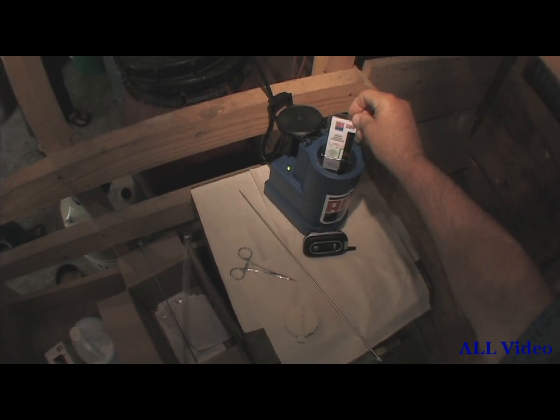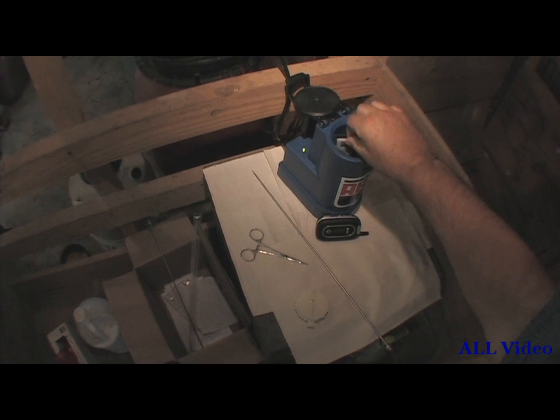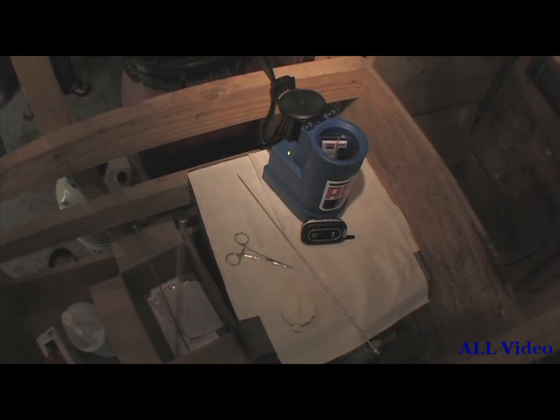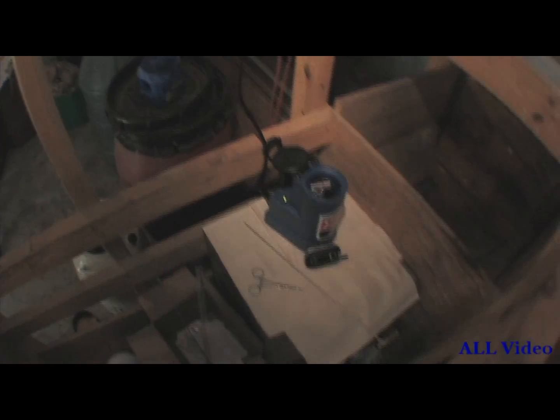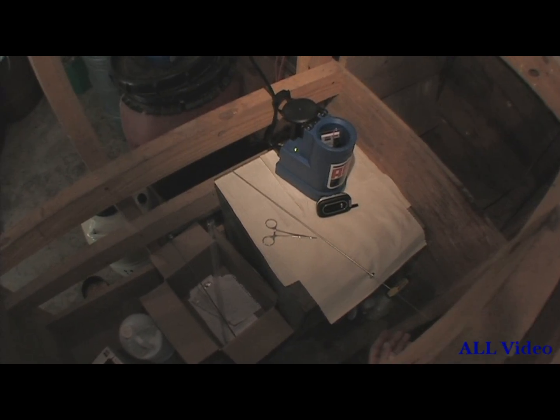The green light's on. This thing tells me it's about 96 degrees, which is ideal — just a little body heat. The straw's right there. It'd be a perfect place to film me cutting it off; I can cut it from right there. So we're about ready to do it. Okay, it's been one minute.